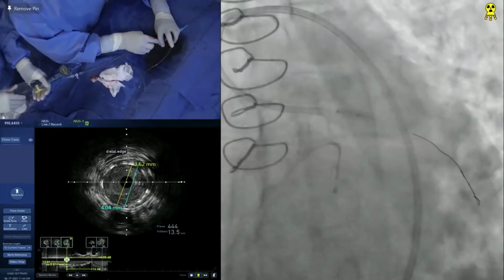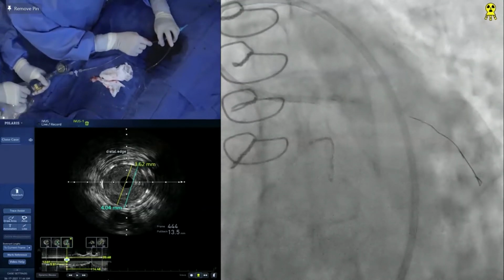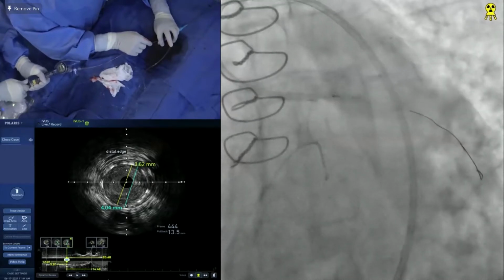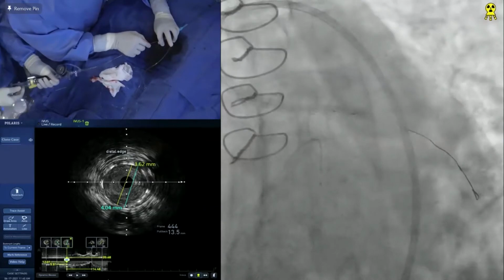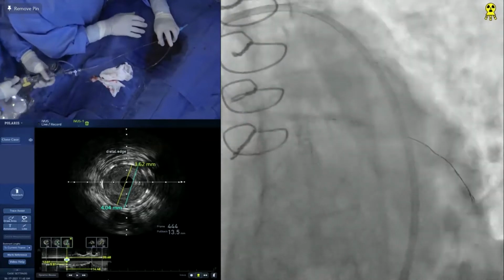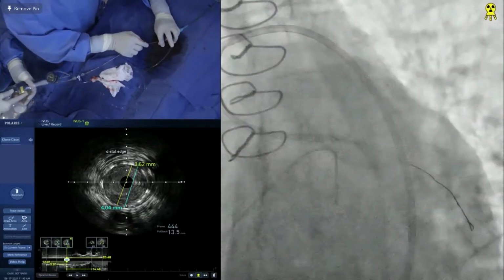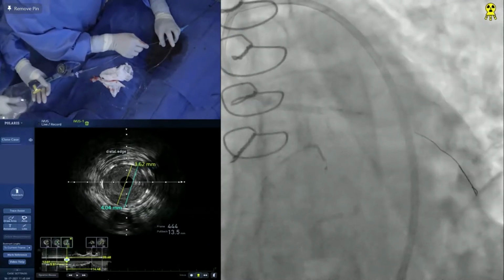I know we've been asked about imaging, and that's okay. Yes, a lot of IVUSs, we do it more as a part of the symposium. And I know that a lot of IVUS fanatics will do multiple IVUSs between various steps, but that's okay. That's a different strategy. Negative. But as long as whatever you do, you get a good result, that's what matters. You go again. I think we opened it up now. Yeah, I think it expanded now.